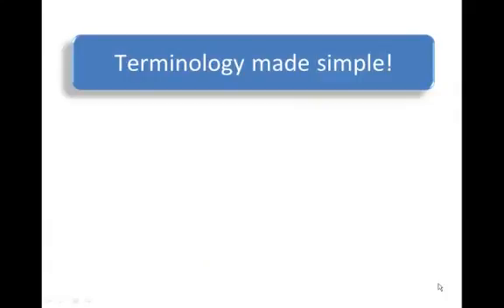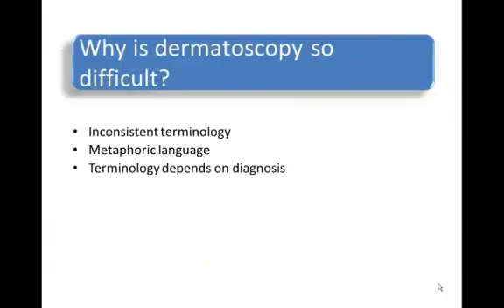Terminology made simple. Why is dermatoscopy so difficult? Well, because of three major reasons. First, because of inconsistent terminology. Second, because of metaphoric language. Third, because the terminology in dermatoscopy depends on diagnosis. Let's start with inconsistent terminology.